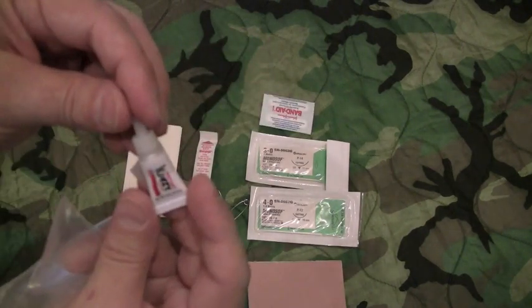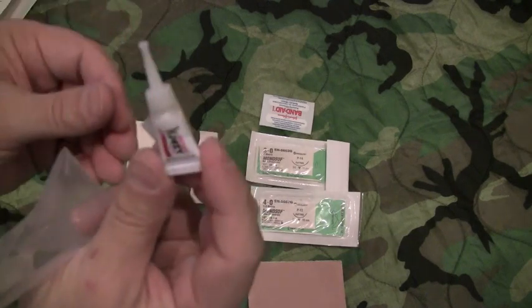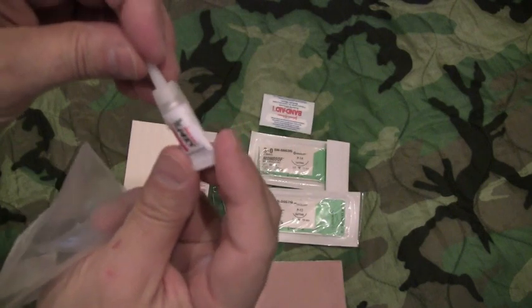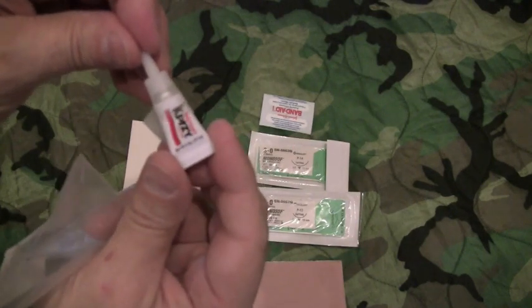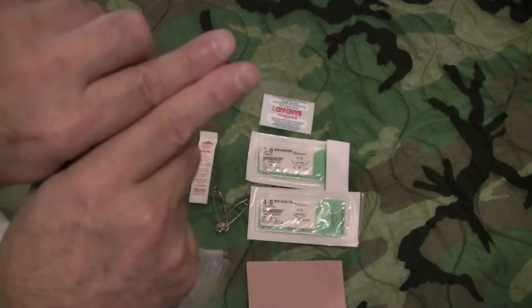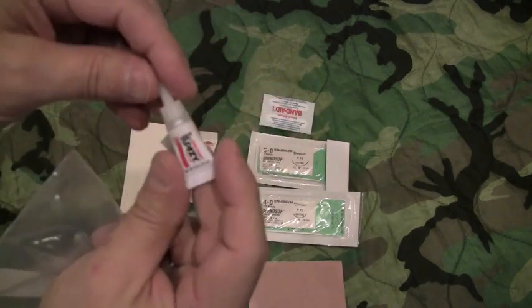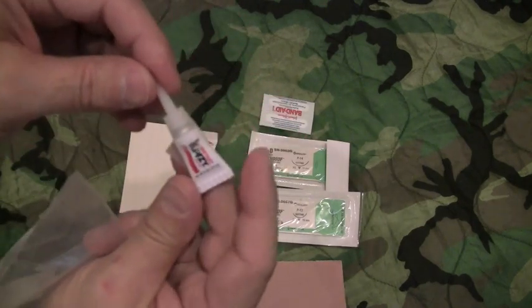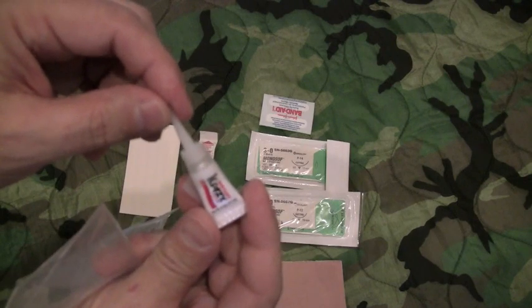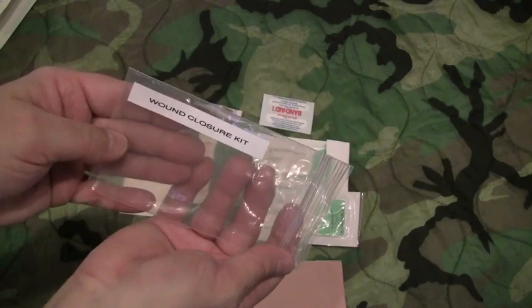And we can talk about this in another video if anybody's interested, but this is a small one-time use crazy glue, and you can use this for small wounds where the wound edges are closely approximating each other, and it's not on a stretched surface where the wound is going to pop open. If you clean it and irrigate it really well, this is not a bad option for closure, and it's pretty quick. Okay, that's the wound closure kit.